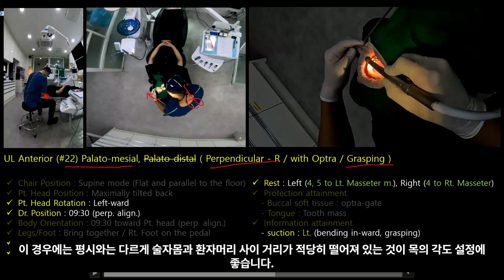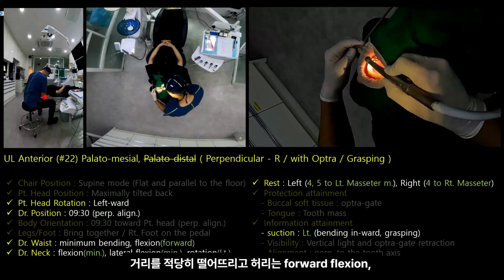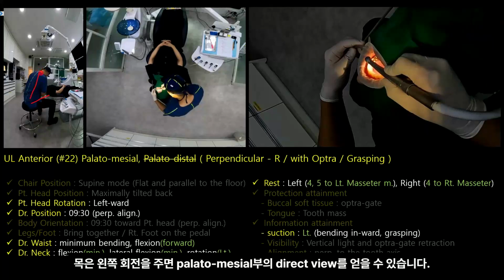In this specific situation, and unlike typical cases, it is advantageous for the operator's body posture if there is an appropriate amount of space maintained between their body and the patient's head. With a moderate distance, the waist is in a slight forward flexion and the neck is also in a slight forward flexion. In that position, a slight rotation of the neck to the left will allow you to get a direct view of the palatal mesial area.